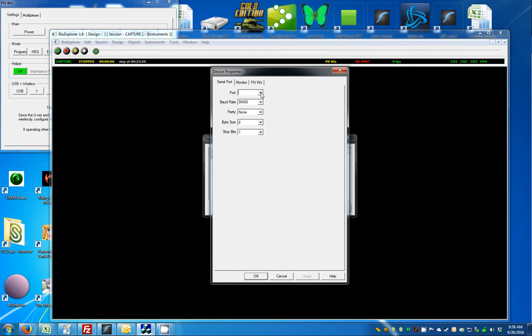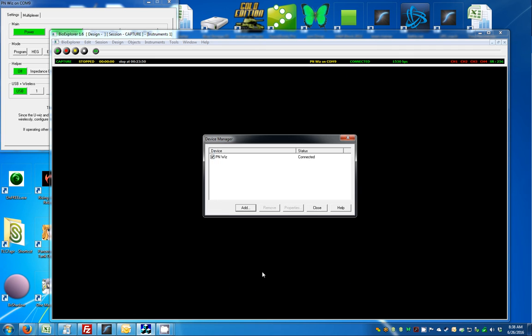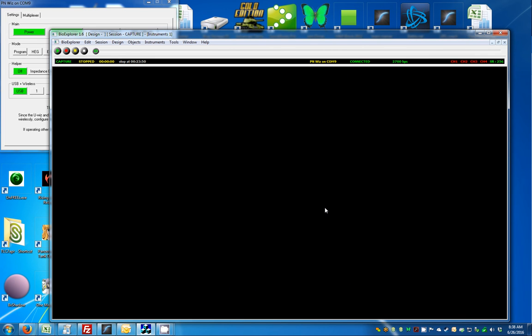Then you select the port. When you installed the driver, it would have assigned a port number, and if you took note of that you would know which one it would be here. When you select the arrow, choose the COM port that was assigned. Then you can close it.